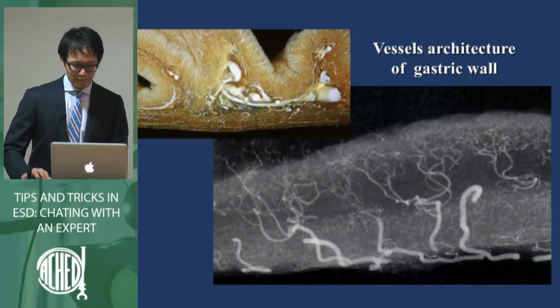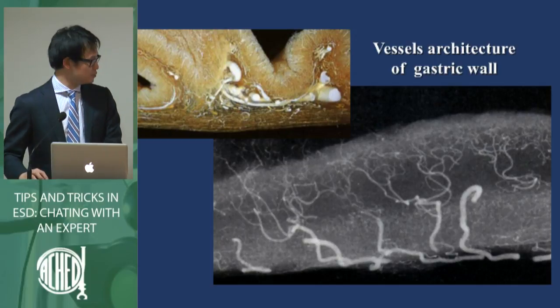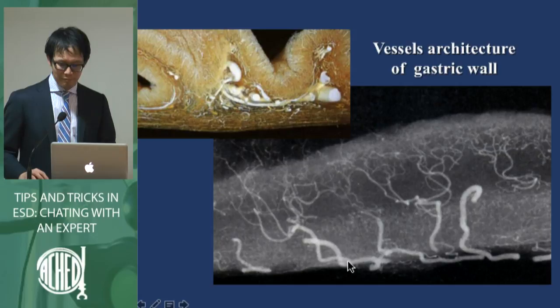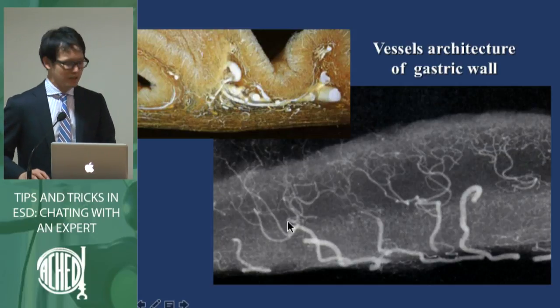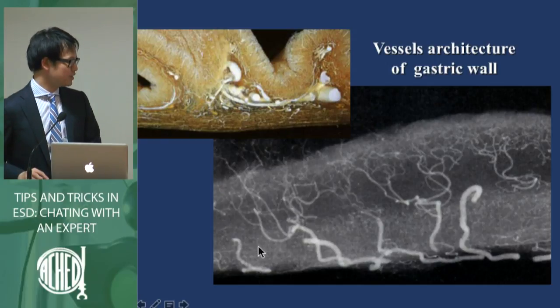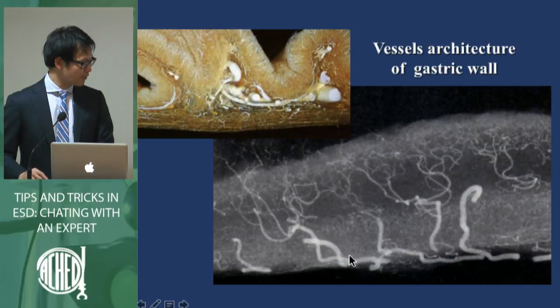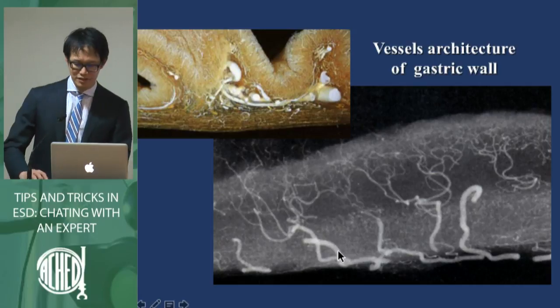So now I'm talking about how to resect in ESD procedures. As you can see, this is the anatomy of the vessels. This is the mucosal epithelium, this is the mucosal area, and this is the submucosal layer. You can see the submucosal layer has fewer vessels compared with just below the mucosal layer, so if you go into the deep submucosal layer, you only have to care about these vessels.